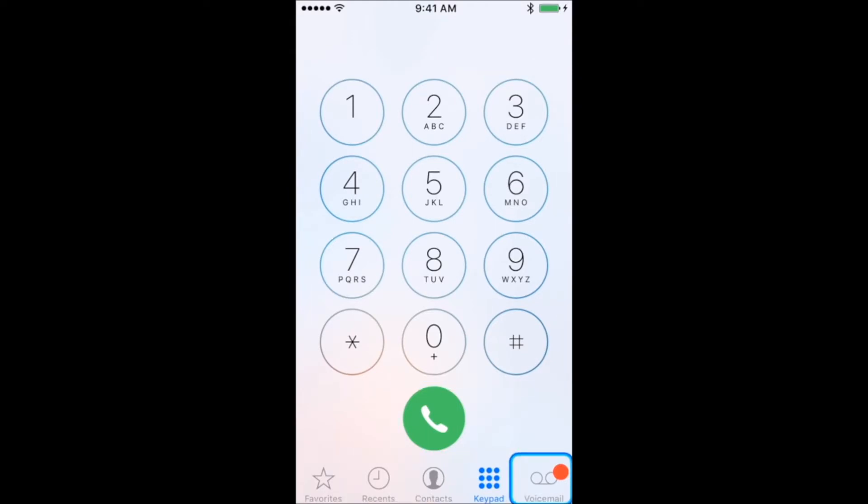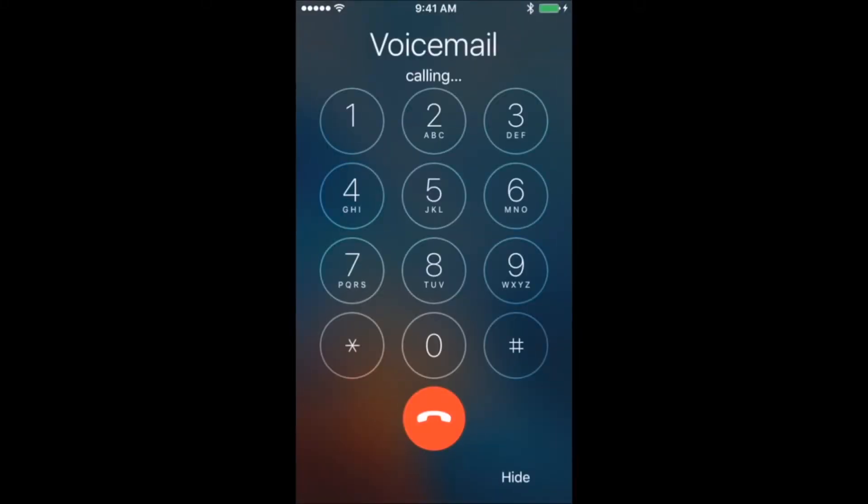To access the keypad, press your switch when the scanner highlights the whole keypad. Press your switch once and the scanner will then select each row individually. Then press your switch in the desired row to step into the individual numbers.